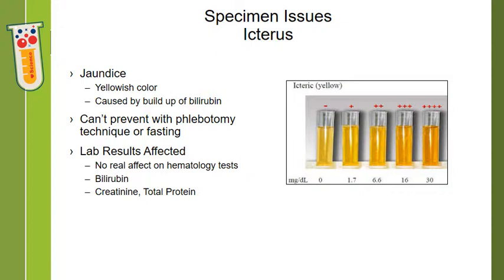Icteric samples will appear yellowish in color, caused by the buildup of bilirubin. You can see in the image the varying degrees of icterus, from 0 to 4+. This really can't be prevented with phlebotomy techniques or fasting, so this is something you kind of have to make notes on occasionally with your results. Lab results that are affected include, of course, bilirubin, but it may also affect your creatinine and total protein. The test results affected are going to vary depending on which test methodology you are using in your lab. Always be mindful of what methodology you're using and how these specimen issues may affect results.